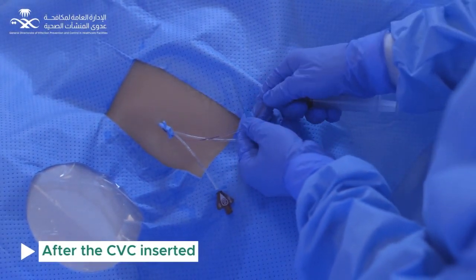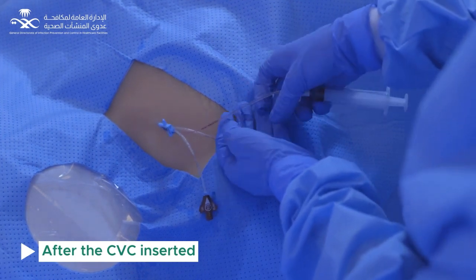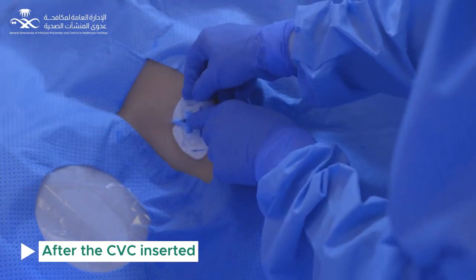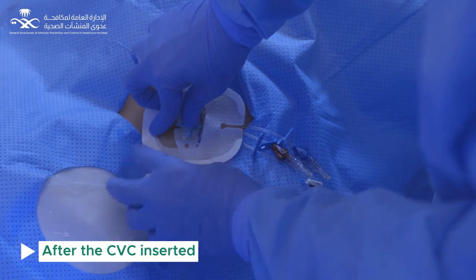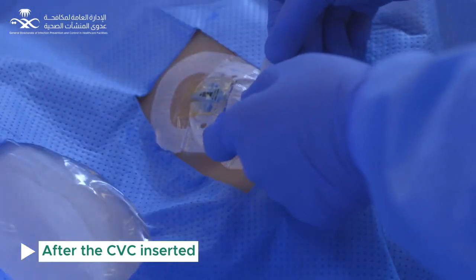Once the central line is in place, aspirate and flush all lumens and reclamp and apply disinfected lumen caps. Apply the stabilization device. Use chlorhexidine impregnated dressings. Put the needleless connectors on all open connections. Cover needleless connectors with disinfecting antimicrobial caps. Apply the information label over the dressing.